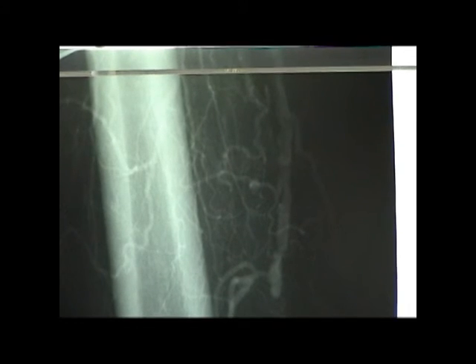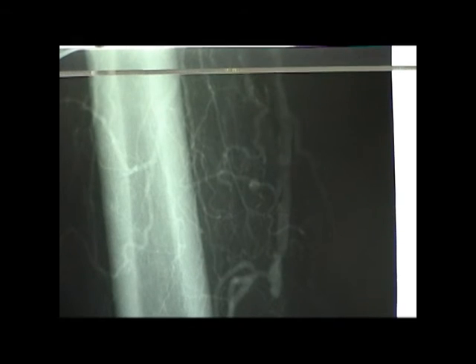Again here we can clearly see the femur on the left and a very poor quality looking femoral artery on the right, and indeed just about there I think you can see that the artery is occluded completely. You can see blood leaving here in smaller vessels.